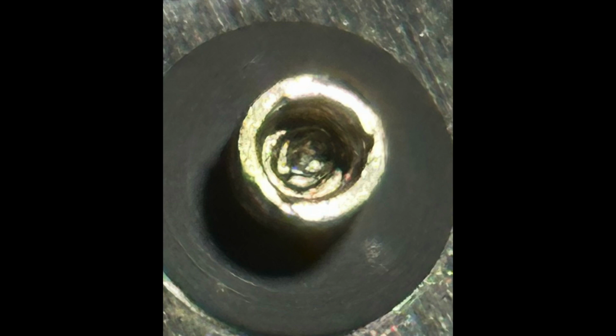To remove a fractured abutment screw is not very easy, because it's not the loosened abutment screw that fractures, it's always the over-tightened one that fractures. So an over-tightened abutment screw to remove is close to impossible. There are some removal kits on the market, but none of them are really the one and only that helps us. As you can see from this picture, in solving the problem, the only option was to remove the implant.